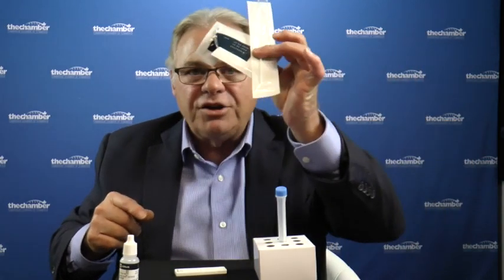There are some things that are hazardous waste. The paper actually is just general waste. You can throw that in the garbage. The vial and the used screening pad are considered by the Ontario government as hazardous waste. Keep those in a separate container, and you're welcome to bring them back to our office when you pick up your refill. And we have a bin here that will collect the hazardous waste, and we'll make sure it's properly disposed of. Thanks very much.